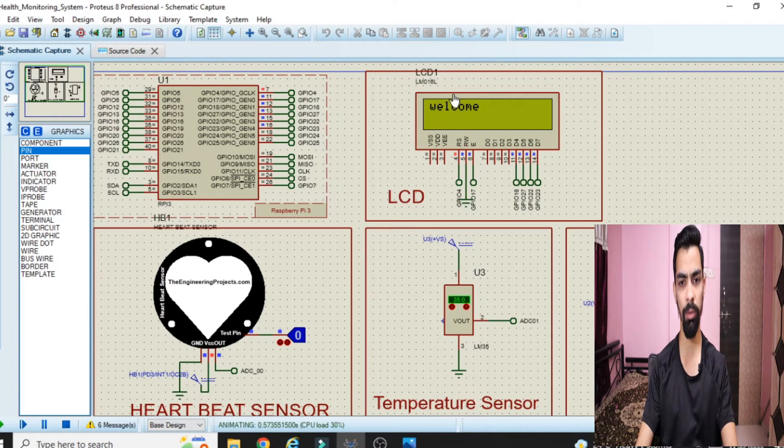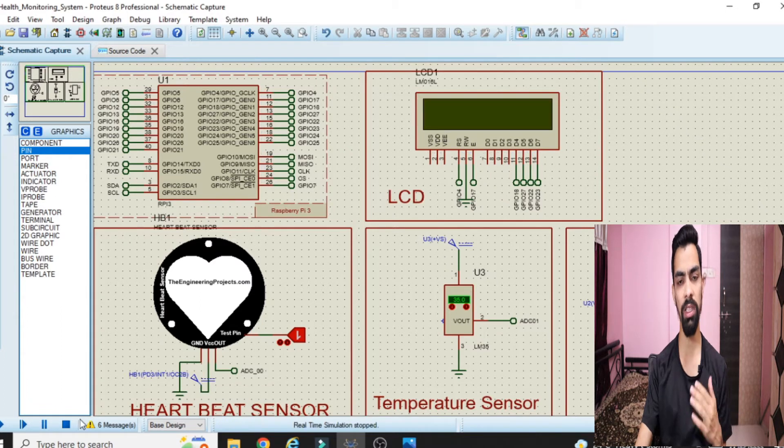Now again the same welcome message appears, then waiting for input. I will give the signal again and wait 10 seconds. After 10 seconds you can see heart rate is 100 and temperature is 35, because I set the temperature to 35. This is the complete idea behind this project. Now we will see the hardware part.